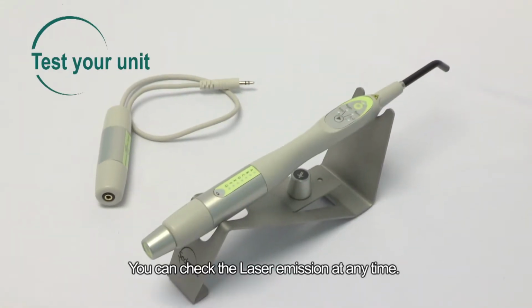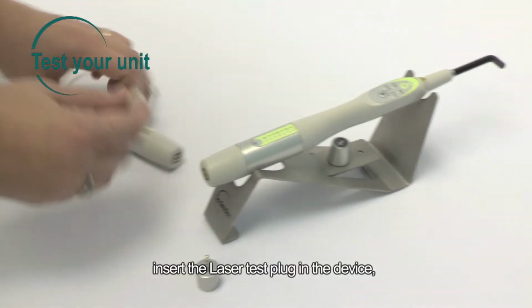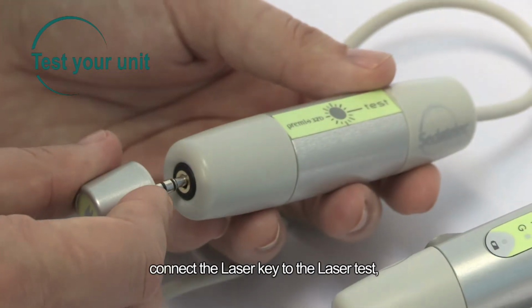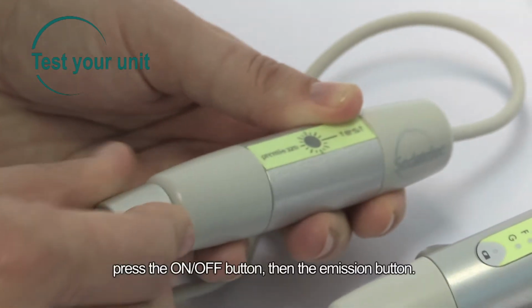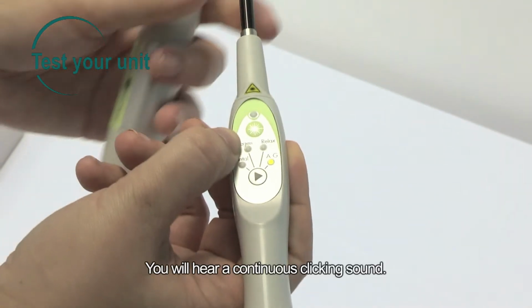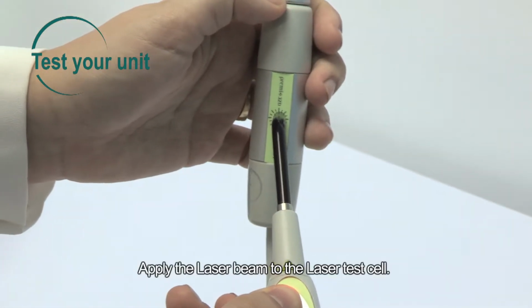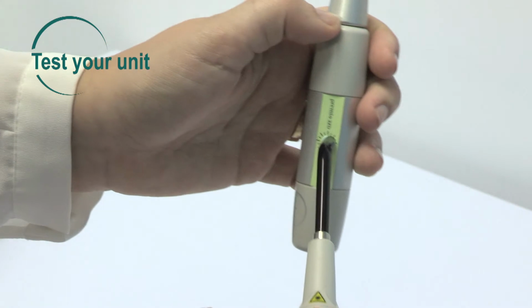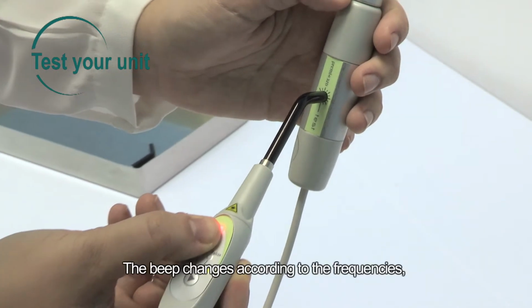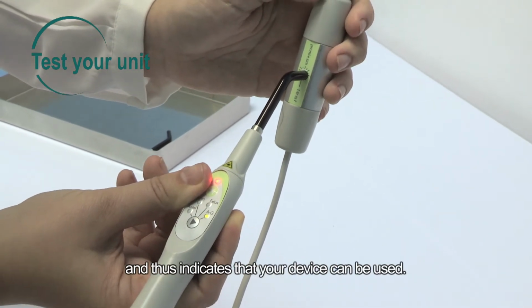You can check the laser emission at any time. To do so, remove the laser key, insert the laser test plug in the device, connect the laser key to the laser test, press the on-off button, then the emission button. You will hear a continuous clicking sound. Apply the laser beam to the laser test cell. The beep changes according to the frequencies and thus indicates that your device can be used.